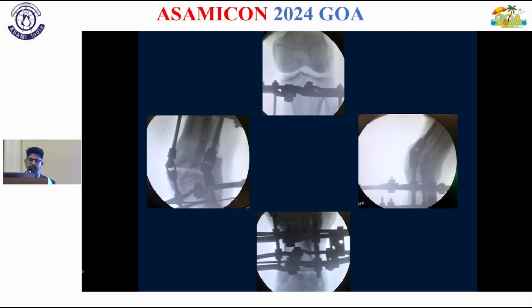When you rotate the leg, there will be a point at which the deformity would be maximum. In that position, the hinge should be collinear and at the apex of the deformity. Second, if you rotate the leg, there will be a point where the deformity will be gone. In that condition, the hinges would be at the same level.